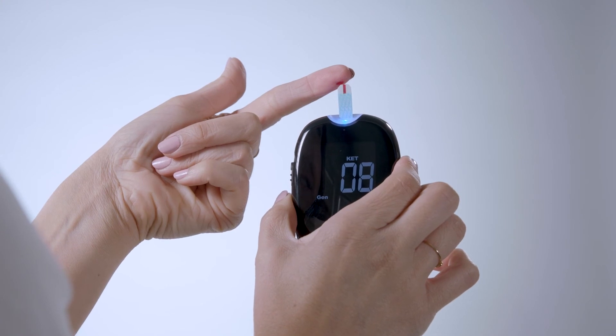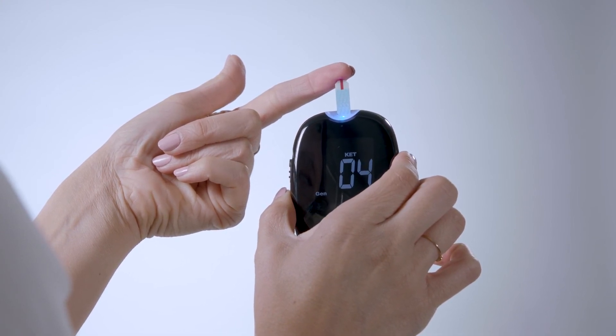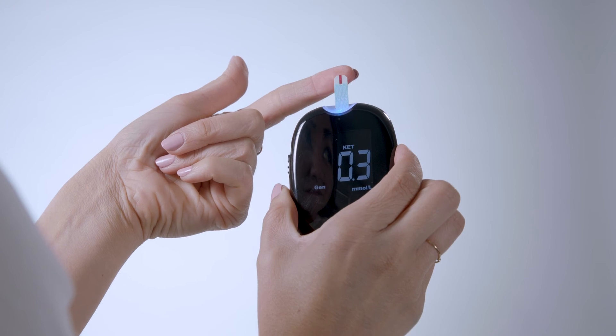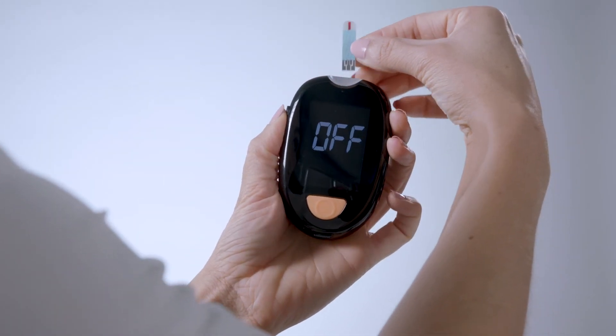Squeeze your finger near the site without touching the blood to help produce a generous pinhead-sized amount of blood. Place the absorbent hole at the end of the test strip at a tilted angle up to the blood drop. Hold in place until the meter beeps — about 10 seconds. Your ketone level will appear on the device screen.